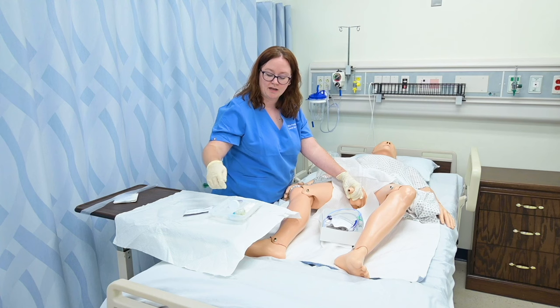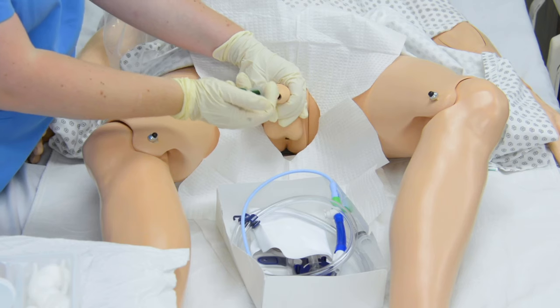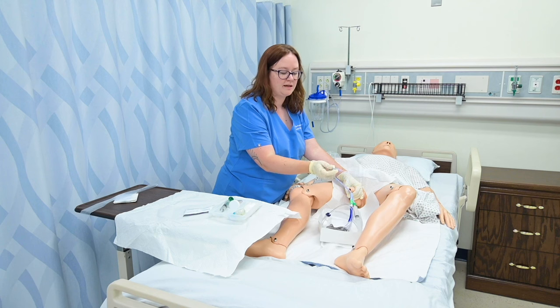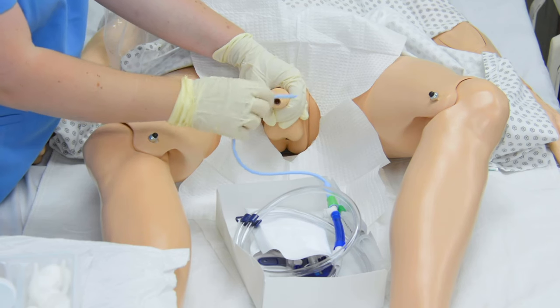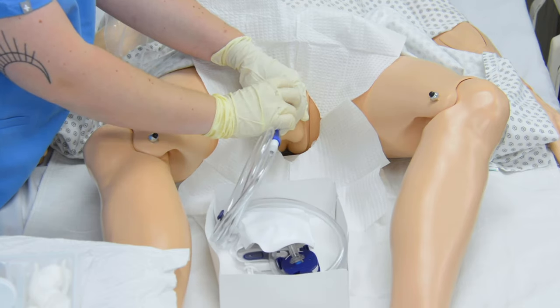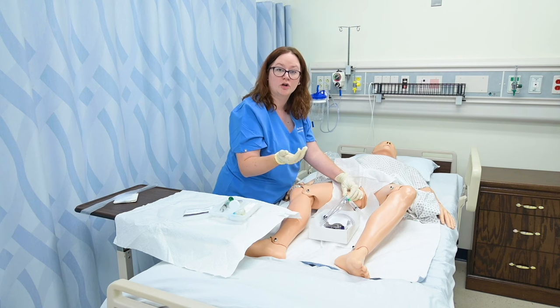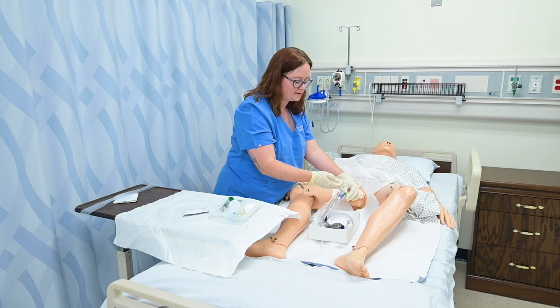At this point, if it's ordered and appropriate, I would take the syringe of lubricant — which sometimes has lidocaine or a numbing cream in it — insert it into the tip of the penis, and inject some of that lubricant. Then I grab the end of the catheter, which I've already lubricated by pouring lubricant into my box. I'm going to insert this into the tip of the penis and ask the patient to bear down. I'm going to insert this all the way into the bifurcation, or Y-port, where the port splits off — literally as far as the tubing allows — because the male urethra is longer than a female's. Regardless of whether I see urine in the tubing, I keep inserting until I reach the Y of the tube. Then I inflate the balloon by pressing down on my syringe.